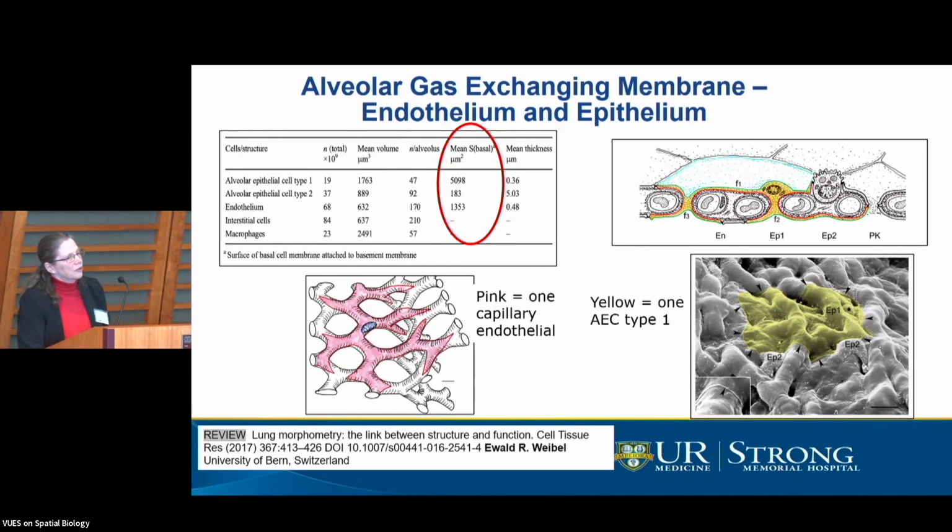We also end up, as others have said, getting blurring of the protein markers because they're so tightly opposed and overlapping each other. And so annotating those cell types becomes very difficult. We see multiple markers of different cell types that are hard to annotate or inaccurately annotated as a specific cell type.